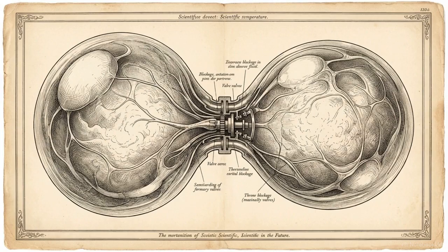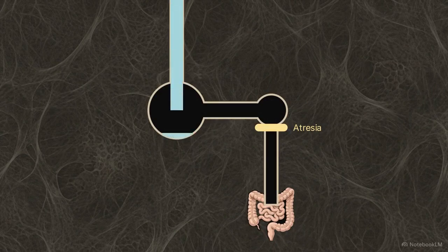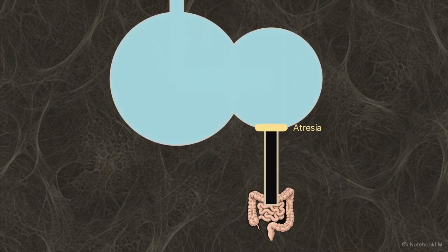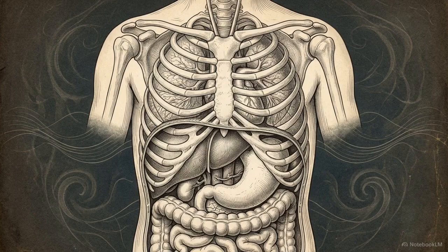Topographical obstructions within the internal organs produce their own distant cascades. The classic double bubble sign seen on an antenatal ultrasound or MRI is a prime example. The mechanism is duodenal atresia. A physical blockage in the GI tract causes backed-up fluid to dilate both the stomach and the proximal duodenum simultaneously. Moving upward to the chest cavity, we find congenital diaphragmatic hernia, or CDH.